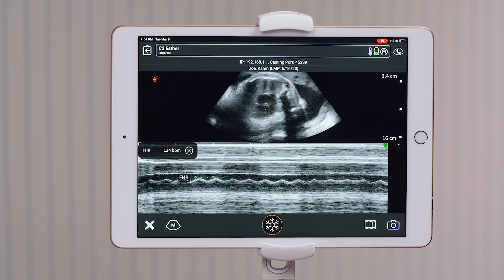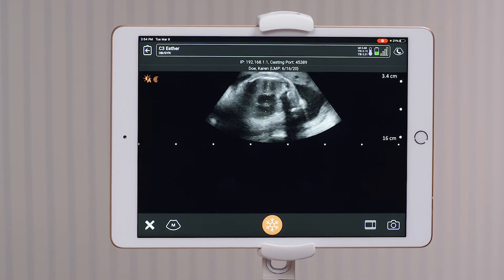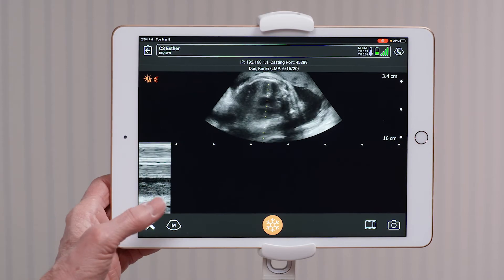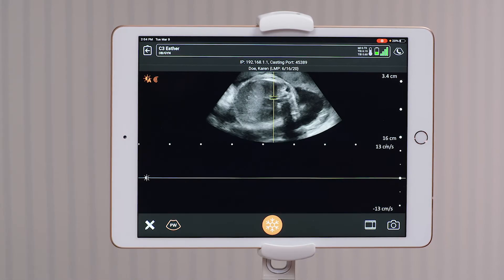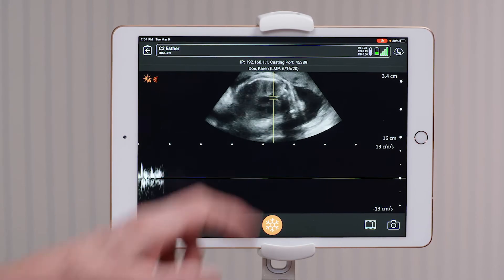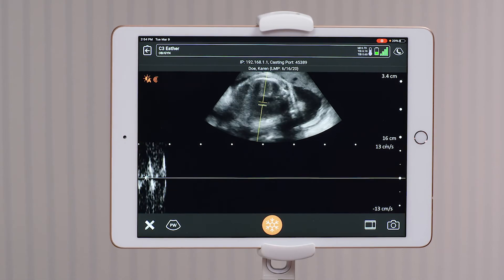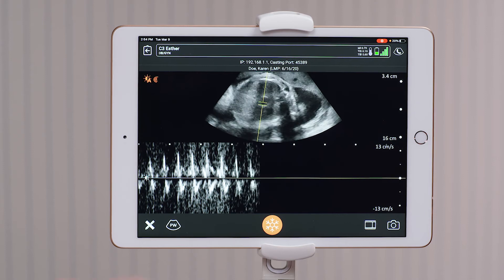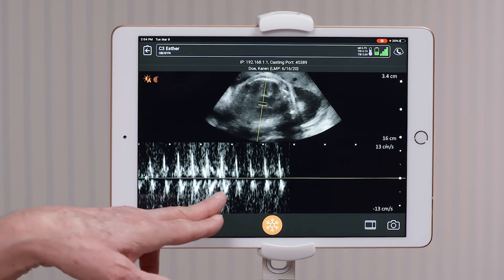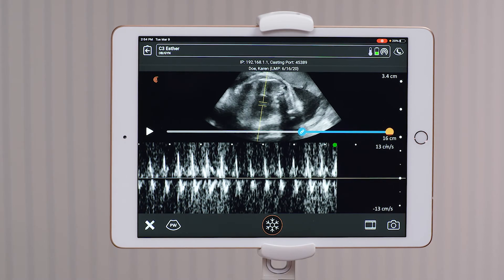To use pulsed wave Doppler, you would go to the modes icon and select pulsed wave Doppler, place the Doppler gate into the fetal heart, and once you have a good tracing, you would freeze the image and measure again from peak to peak.